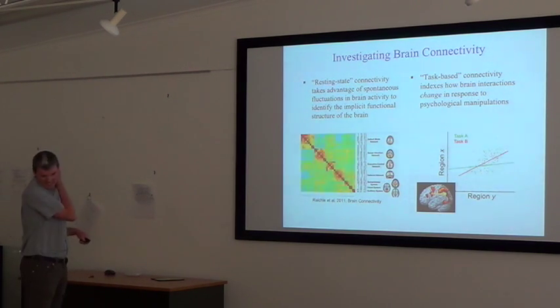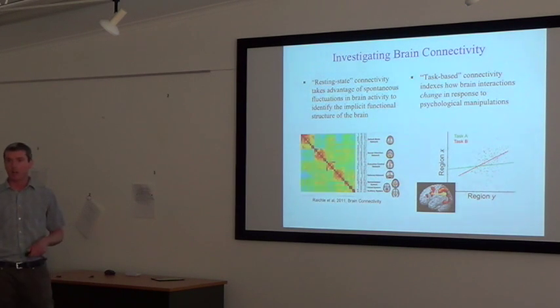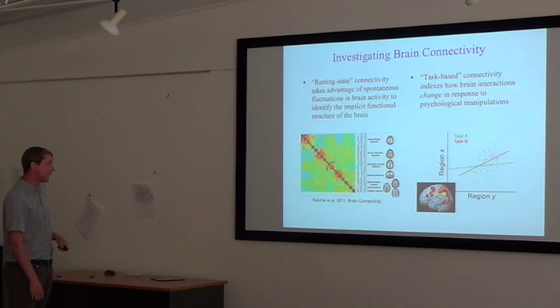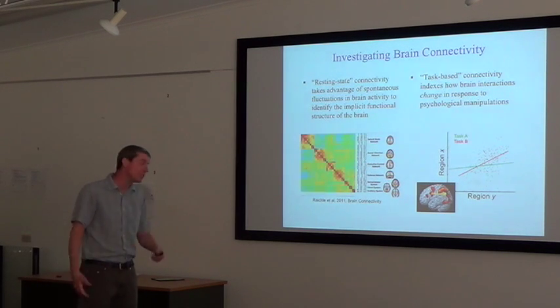And over the past 5 years particularly, there's been an explosion of research in resting state connectivity in pathology and psychiatry and in neurology, because in our quest for biomarkers, this is nice, in that we don't need to introduce a task that patients may or may not be able to do very well.